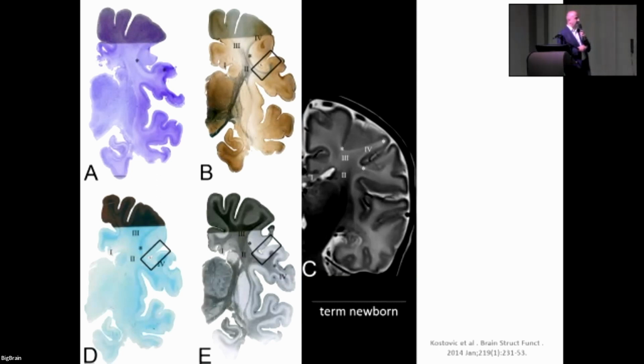And when you correlate this finding to histological section, you will see that this is actually remnant of the subplate. And this remnant of the subplate is very important because it's differently distributed through the brain. So it's different in primary motor and sensory area than in, let's say, prefrontal associative cortex. So developmental changes of subplate are a good way to study maturation of the brain.